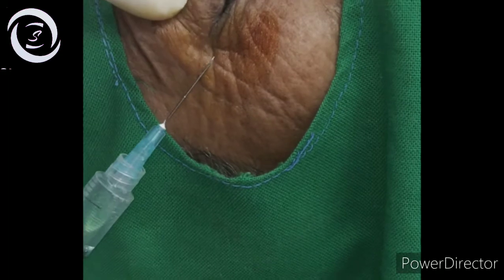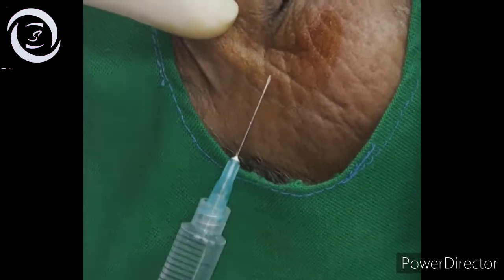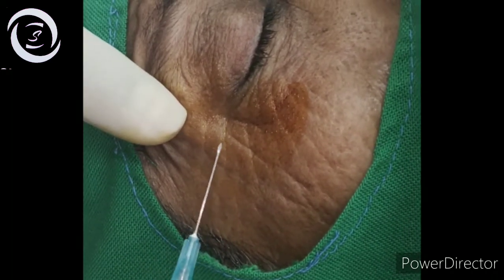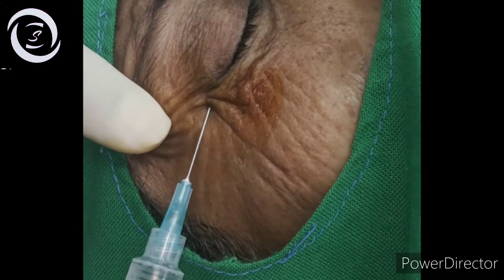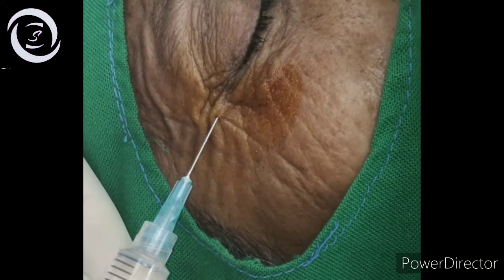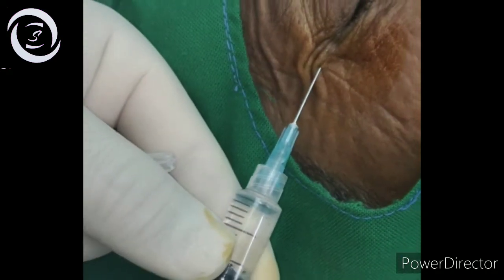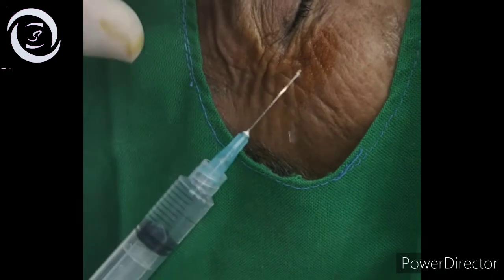Position the needle perpendicularly to the lateral orbital rim and insert the needle subcutaneously. Now gently aspirate the syringe slightly to check for possible entry into a blood vessel. If no blood enters the syringe, then slowly inject 2 ml solution and a bleb of local anesthetic.